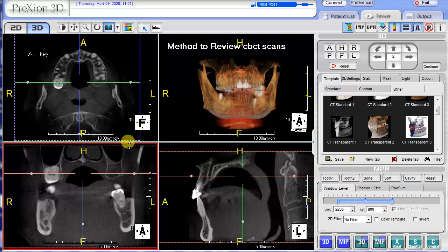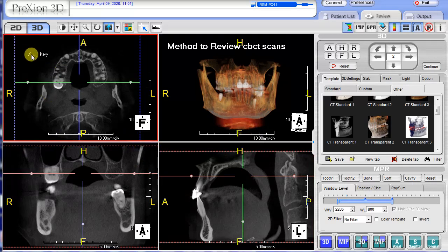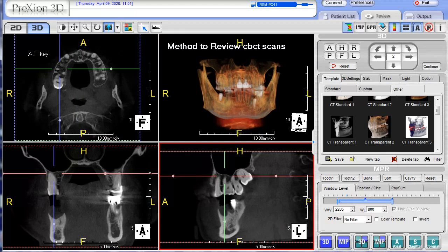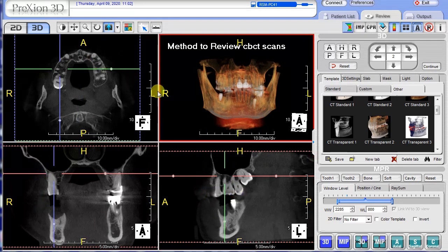To quickly target with the ALT key, simply press the ALT key down on the keyboard. You get your caliper — move it to the right side, left click and release. Again the same result, targeting in all three planes.